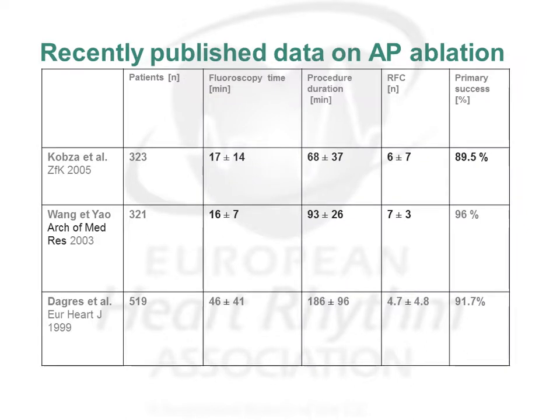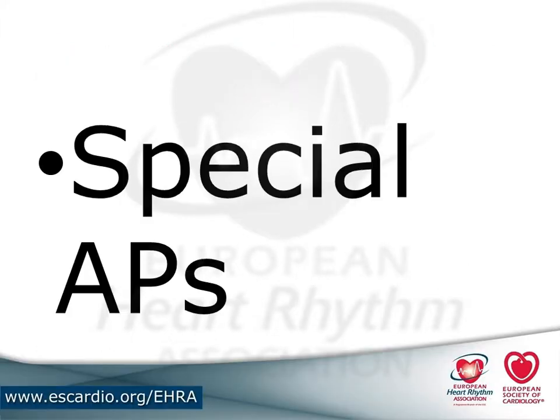How long should that take you? I just showed this for a general overview. It's actually not that recent anymore. But you can see it takes different centers various times. This is a little bit older, so you can see this took a little bit longer, and now times have come down. Fluoroscopy time, I think, is quite long here. Depending on where you want to go, you should maybe make an effort to make that a bit shorter. This is also quite a lot of median applications here, or mean applications. So again, I would try to get at the best position and then make your pathway.